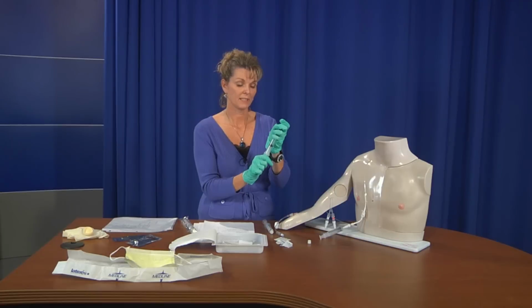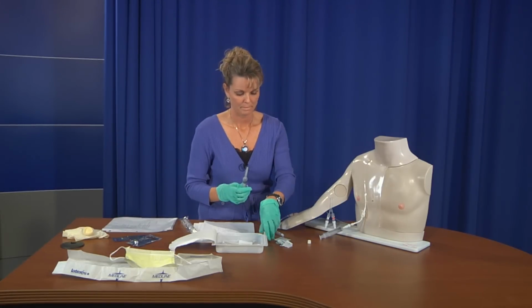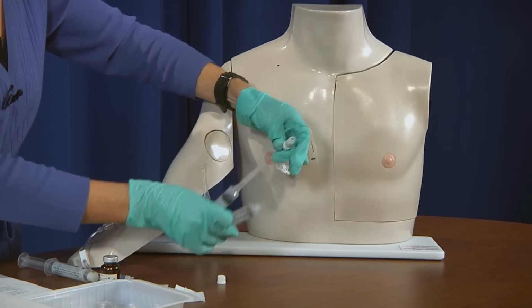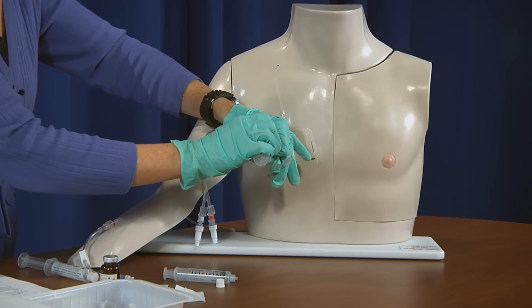And you know how to draw medication. I'm not going there. So I'm going to draw up some medication, and that's what we're going to infuse. So you take this one off. It's clamped. Don't let the end of your port touch anything, because then it would be contaminated.